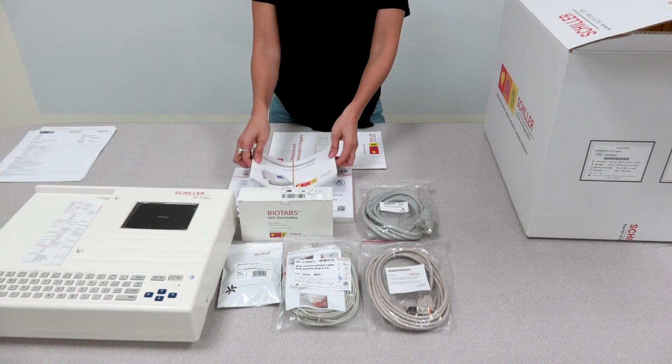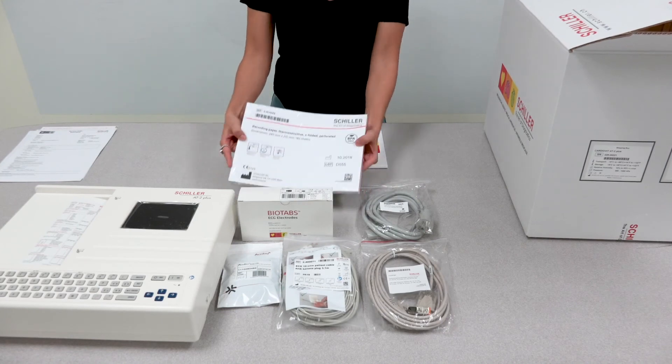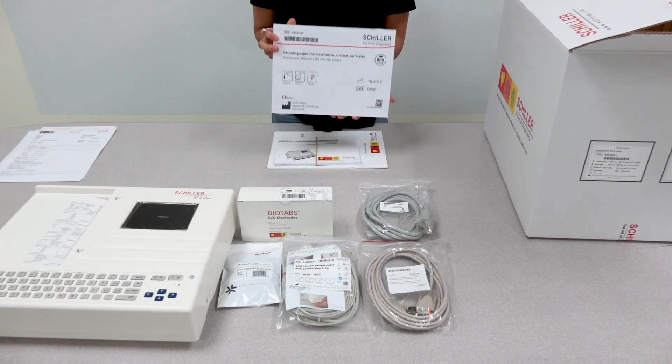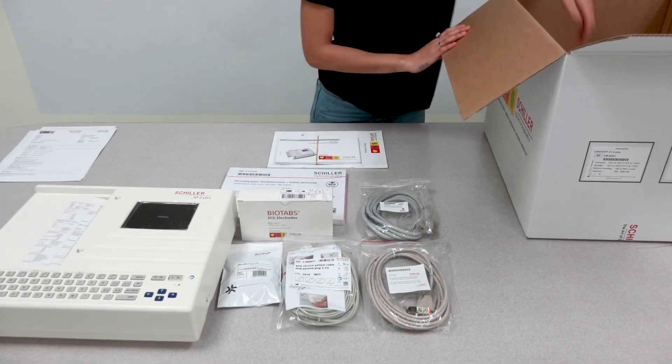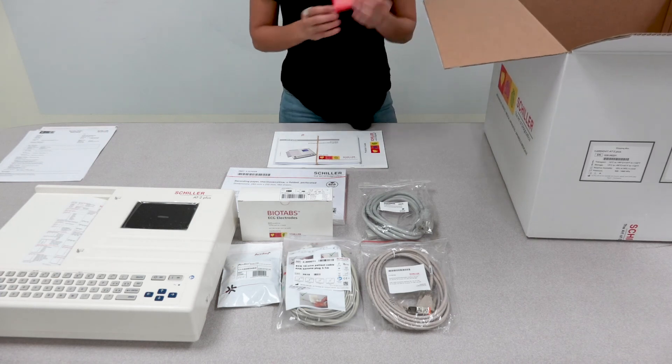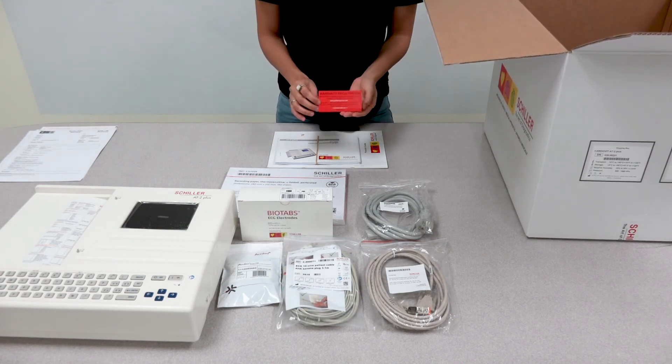It is important to note that the thermoprint paper that comes with the unit is letter size. In the box you will also find the warranty registration card, which indicates the instructions on how to properly register your unit.